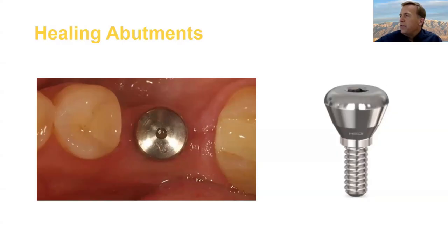And if that's the case, it's not the end of the world. Either you or your surgeon will need to go in there with a laser or a scalpel and just clear that little bit of tissue out. If the patient feels a pinch, that's usually indicative that that's happened. And I mean, it's something I've only heard of a couple times, and I've been doing this for a long time. So I wouldn't really worry about it. I just, if your patient's going, "Ow," really double check your x-ray and make sure your components are fully seated.